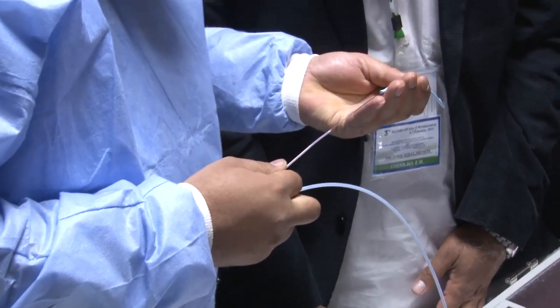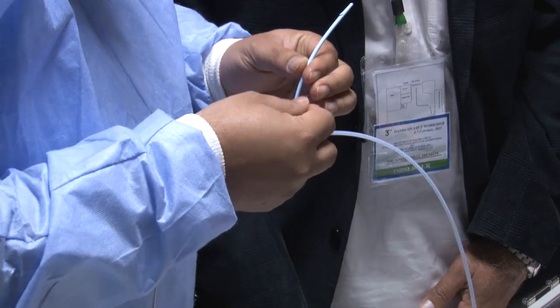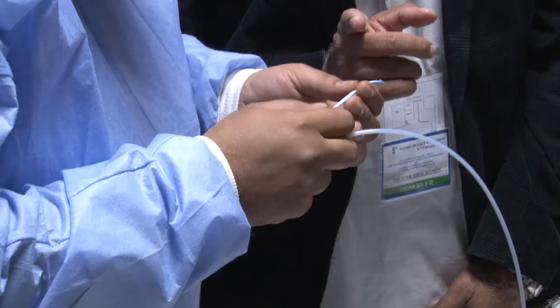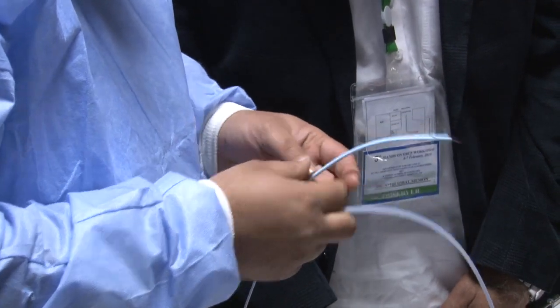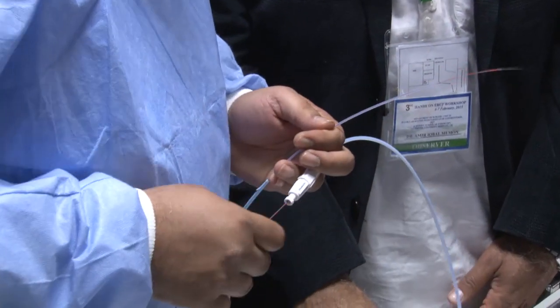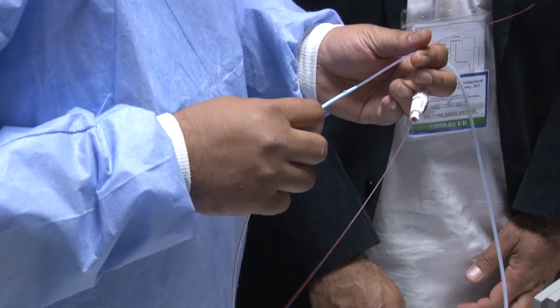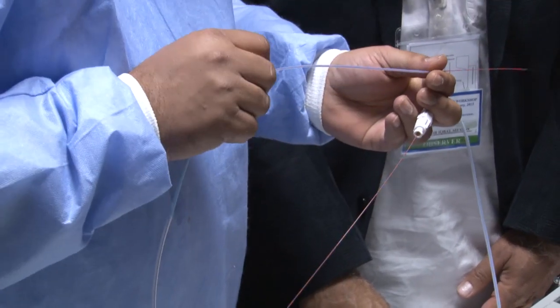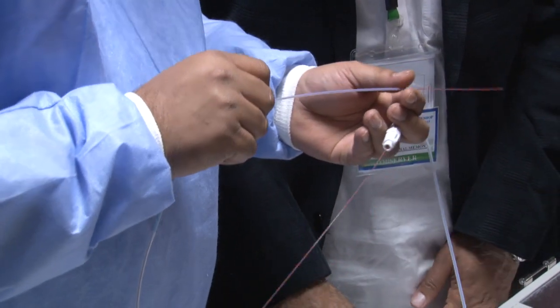No, I don't use balloon at all without sphincterotomy. I don't use balloon introduced into the ampulla at all. There was a time when it came and it was shooted out because there was high incidence of pancreatitis. I was just told only a few months ago that there was apparently some suggestion that you could do a sphincteroplasty without doing a sphincterotomy.